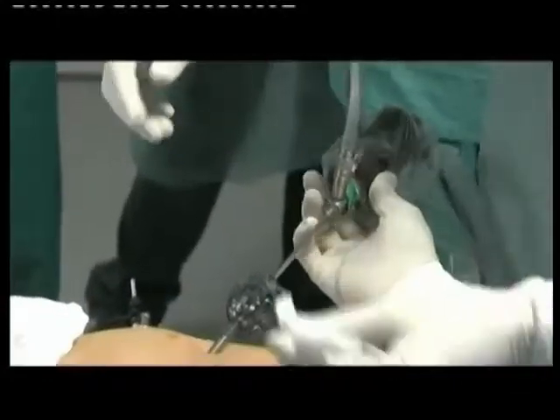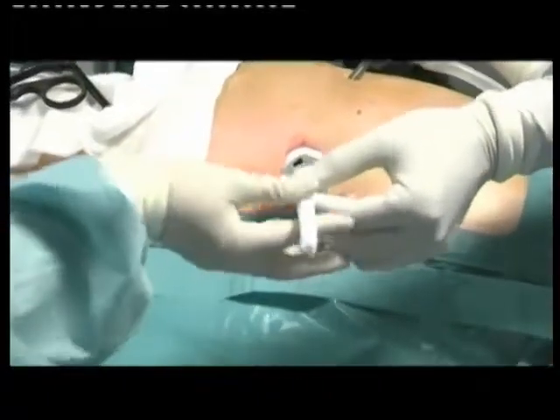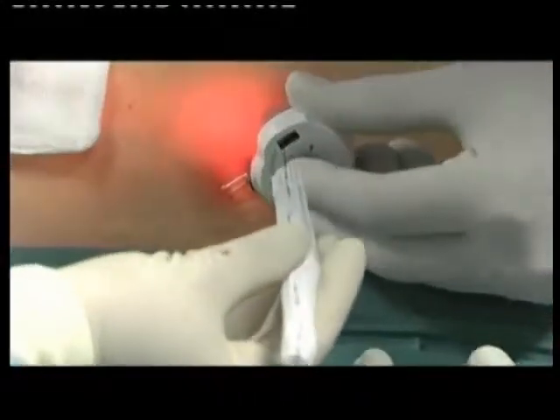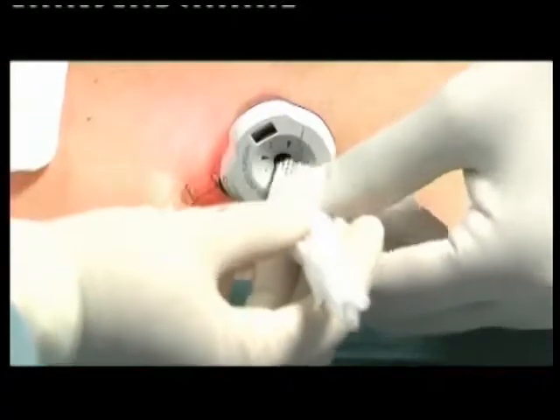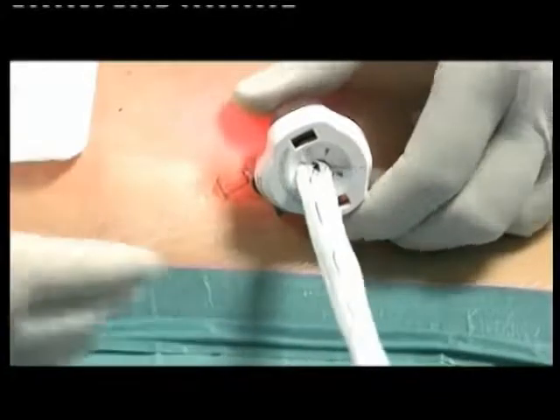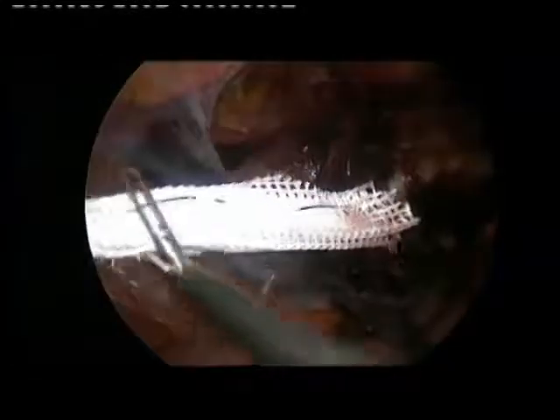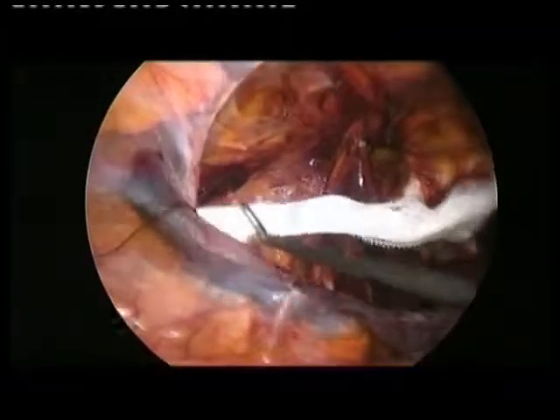Now I have to introduce the mesh in the abdomen. I have only 5 millimeter and 3 millimeter port. So I do like what we do for the drainage. Okay, you see it's not difficult. The mesh goes inside, so we don't need a 10 millimeter trocar, but a 5 millimeter trocar is enough.